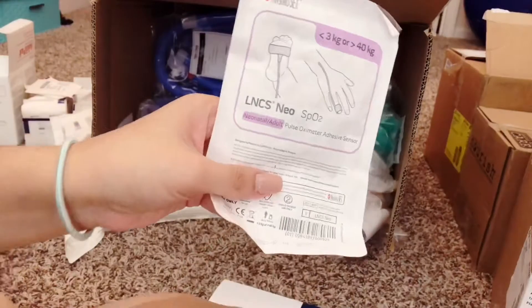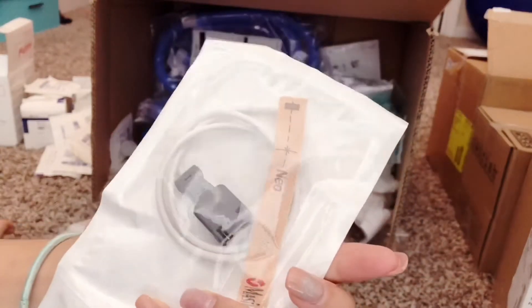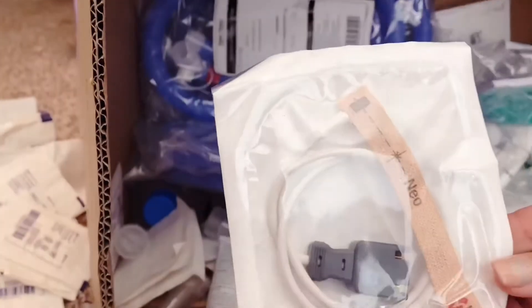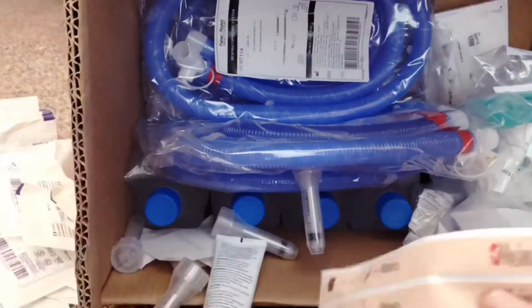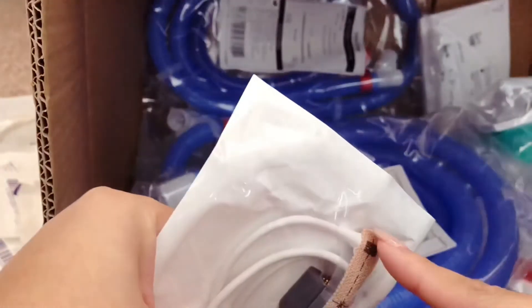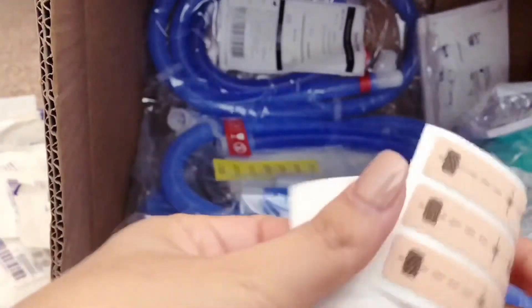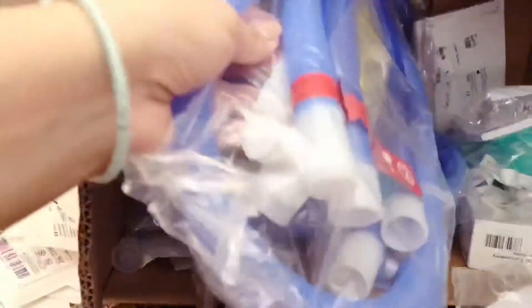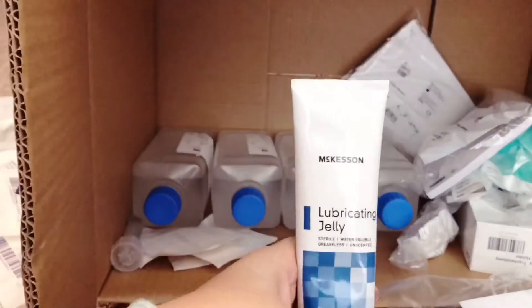This is what we use to track her oxygen levels and heart rate — it's a pulse ox. We connect it to the little machine and put it on her toe preferably, but if she's in a stand or something we'll put it on her hand. I think we only get four of those. We also get extras of the adhesive sensors in case the sticky starts to wear off.